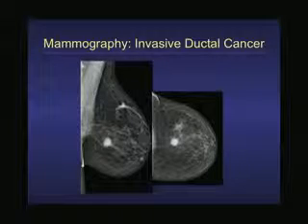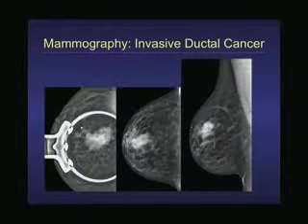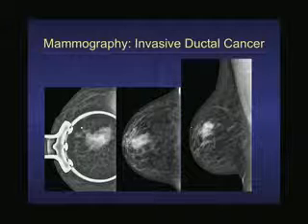This is what an invasive cancer will look like. This big white spot here that has all these irregular margins, kind of spiculated, that's what a cancer looks like. This was a 28-year-old who had something palpable. They put a needle in it. They said it was a fibroadenoma, but they sent her for imaging anyway, and she came to me, and she had this. And it was very irregular. We didn't buy the benign diagnosis. We biopsied again. It was an invasive ductal carcinoma.